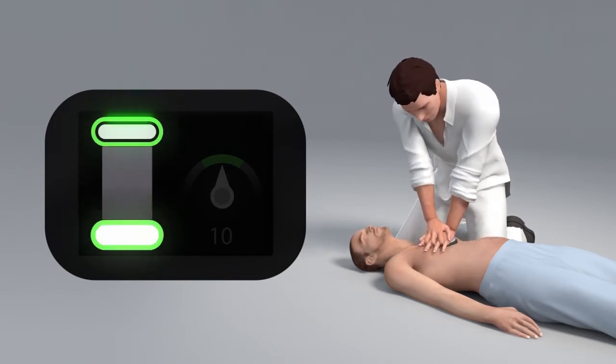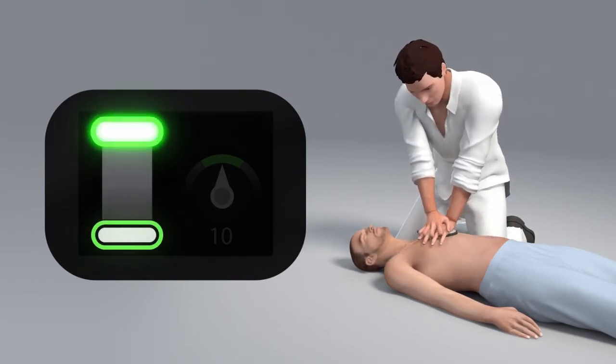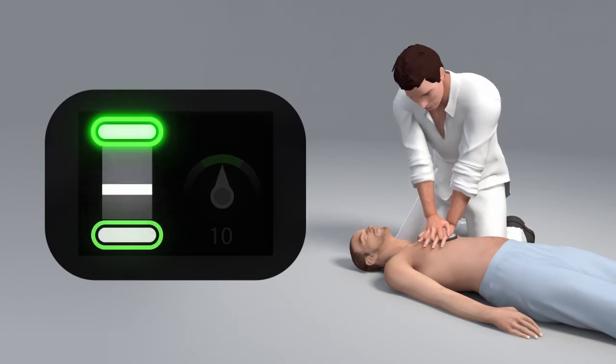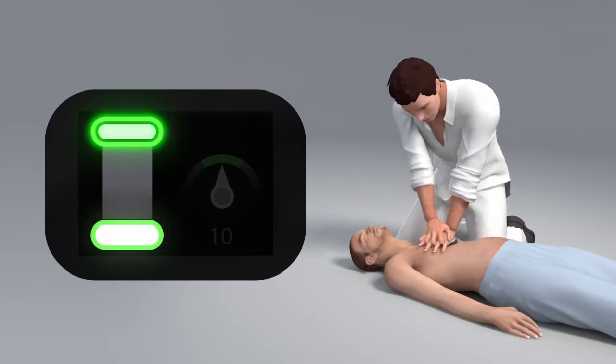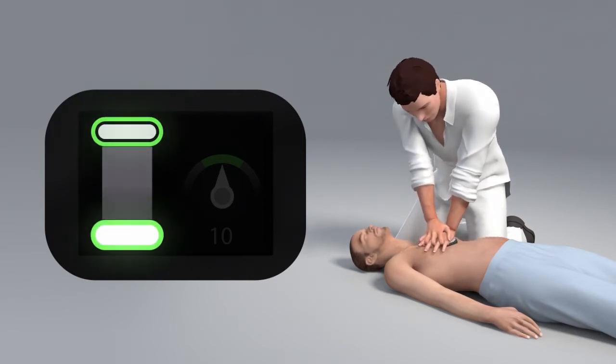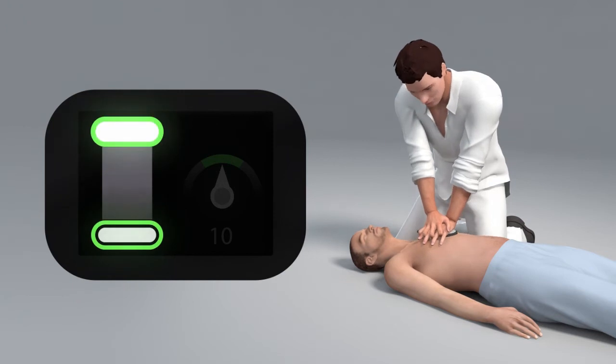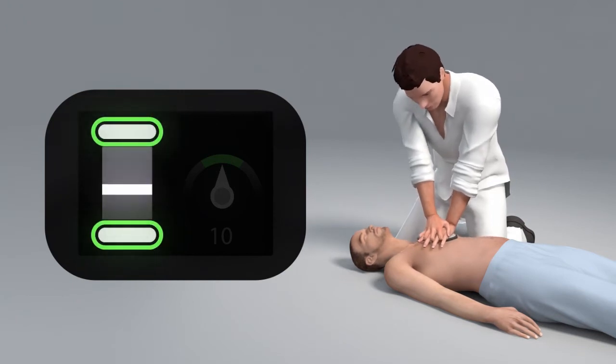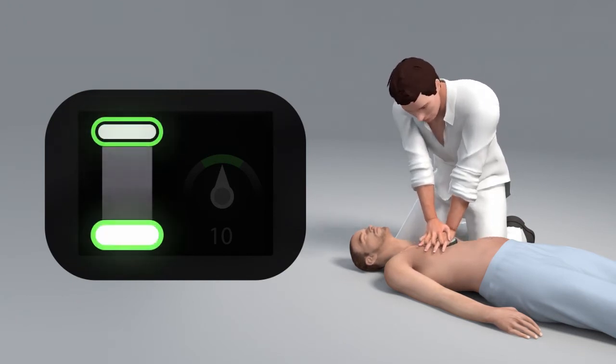The upper target area represents the release target. When this area lights up, you are releasing the pressure off the chest completely.